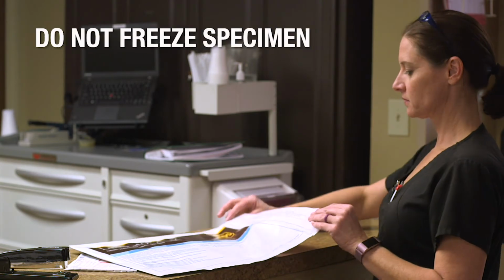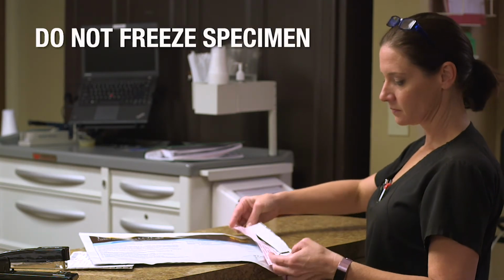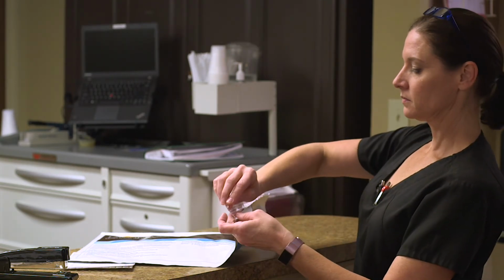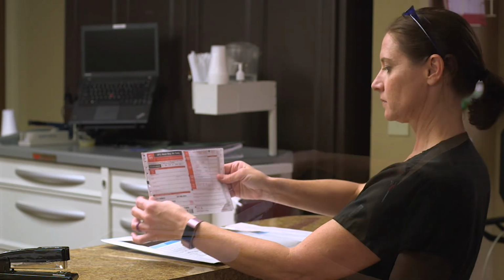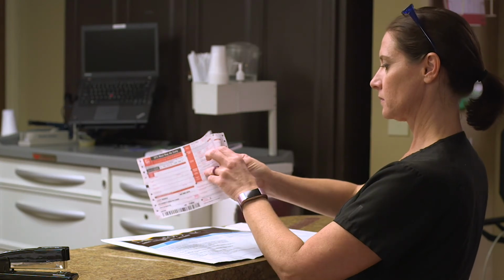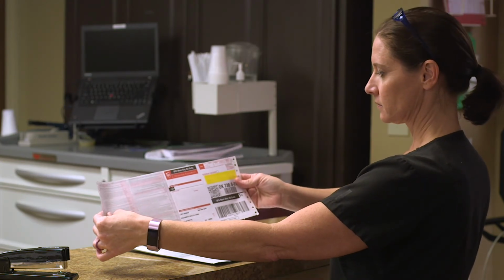Do not freeze the specimen. Ideally, the specimen needs to be shipped by 7 p.m. the day it is collected. If for some reason the specimen cannot be shipped immediately, you may refrigerate the specimen overnight and ship the next day.